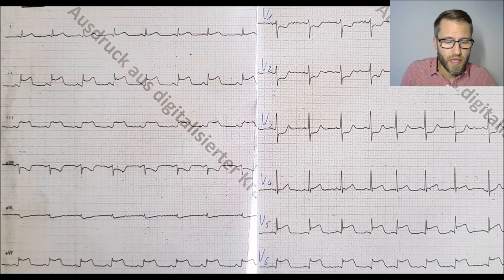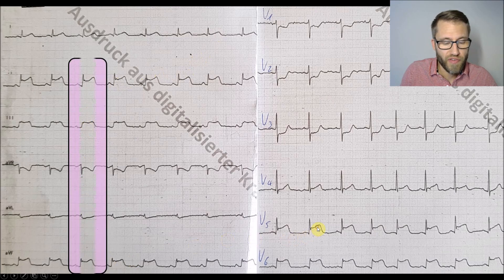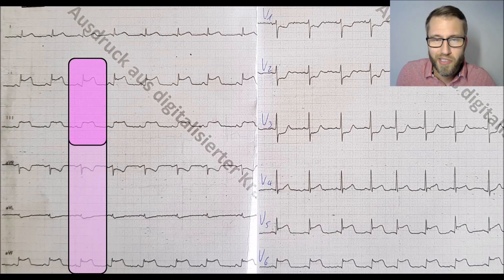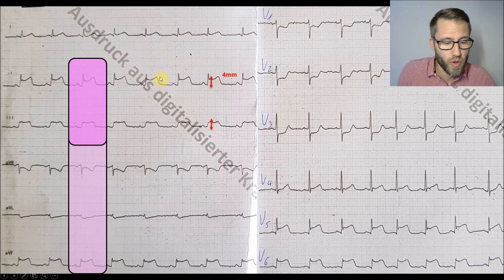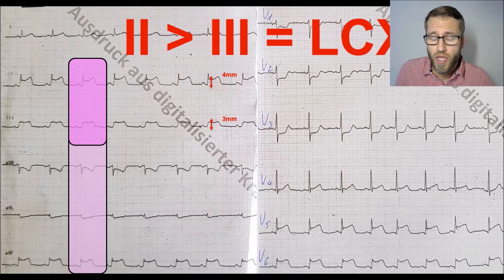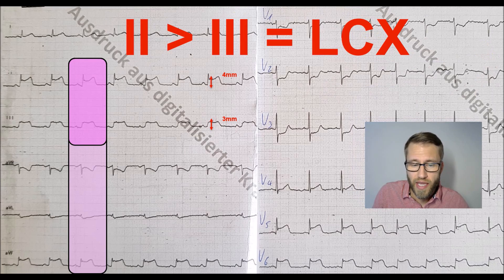Now let's look at this ECG pattern. Almost the same structure — we have ST elevation in leads 2, 3, AVF as well as V5 and V6. We look at the inferior limb leads, especially lead 2 and lead 3, and we measure the ST elevation again. This time we have a value of 4 mm in lead 2 and 3 mm in lead 3. So the ST elevation is greater in lead 2 than in lead 3, and this would encode for the LCX — most probably the culprit lesion is in the LCX.